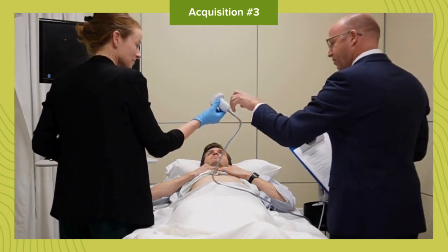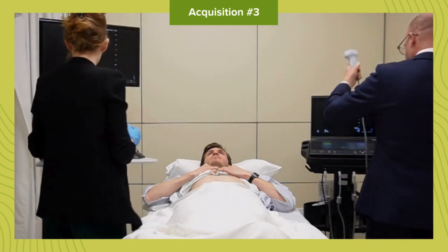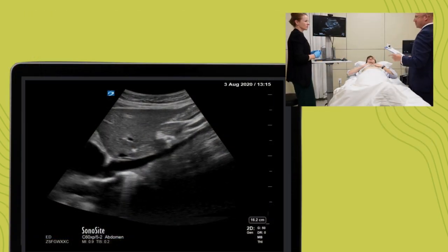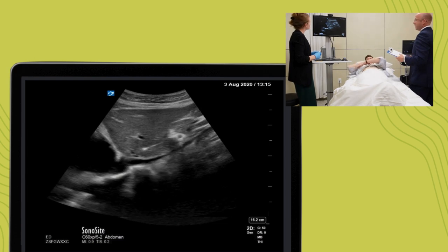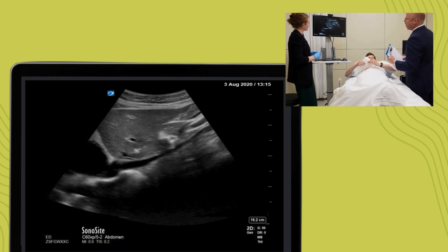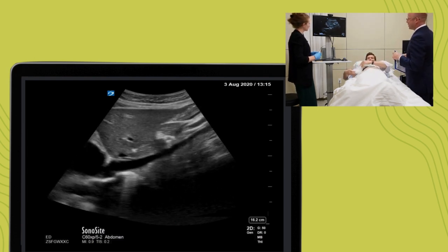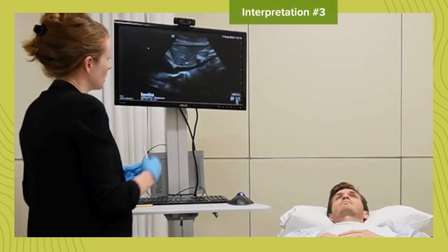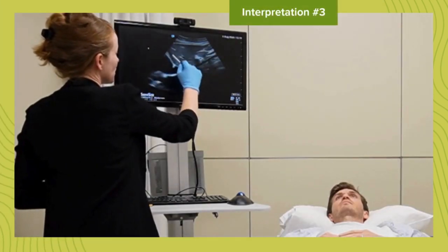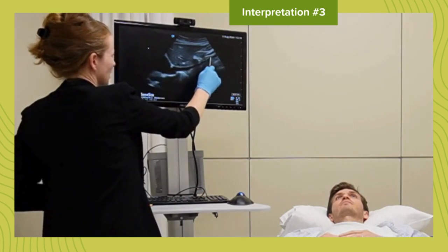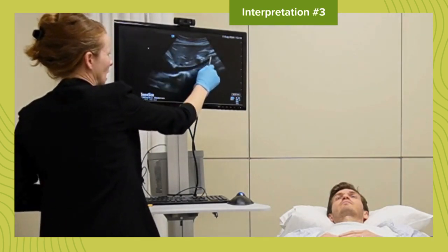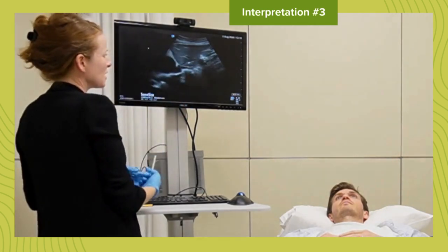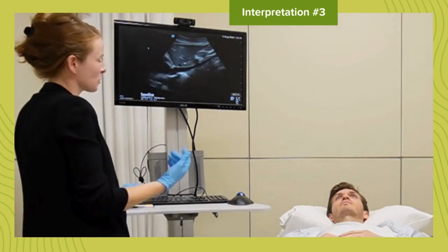I'm going to take that probe back from you. Once again, I'm going to have you draw your attention to the screen. Use your stylus to point out any significant anatomic findings, artifacts, or other findings on this image, and describe how you would interpret it. I'm seeing my liver tissue here. I'm seeing the long axis of the IVC entering the right atrium, and it looks as though it's pretty fully collapsing with respiration.